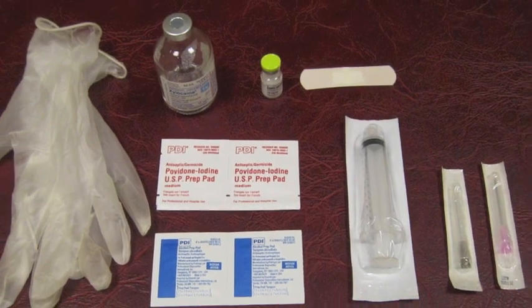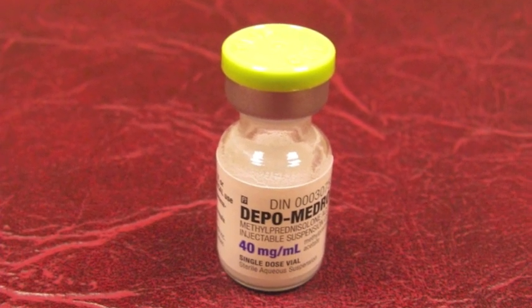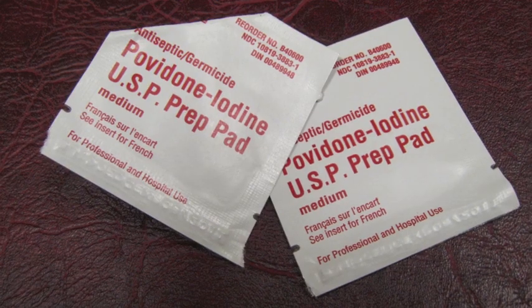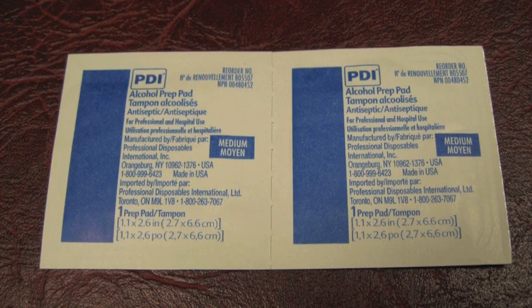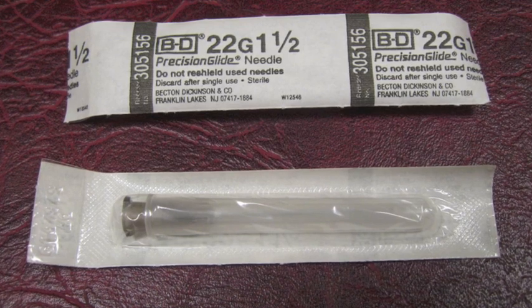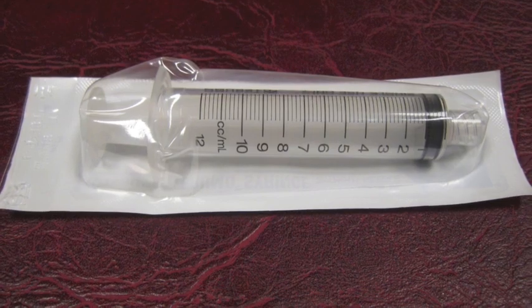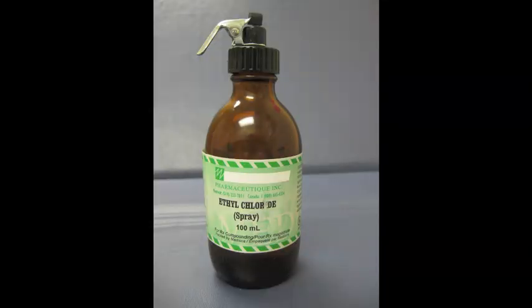The equipment needed for corticosteroid injections includes the corticosteroid medication, 1% lidocaine, skin cleansing agent pads, alcohol pads, a 1.5 inch 18-gauge needle for loading the medication, a 1.5 inch 22-gauge needle for delivering the medication, a 5 to 10 cc sterile syringe, procedure gloves, and a bandage. Sometimes ethyl chloride is used for numbing the skin.